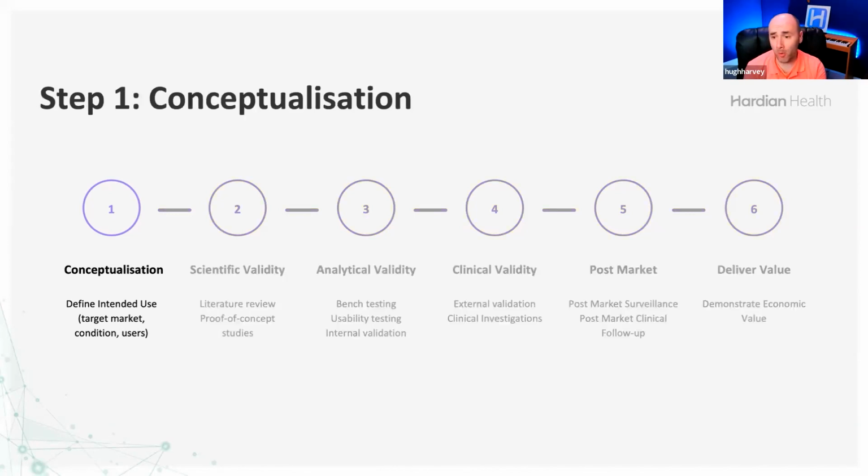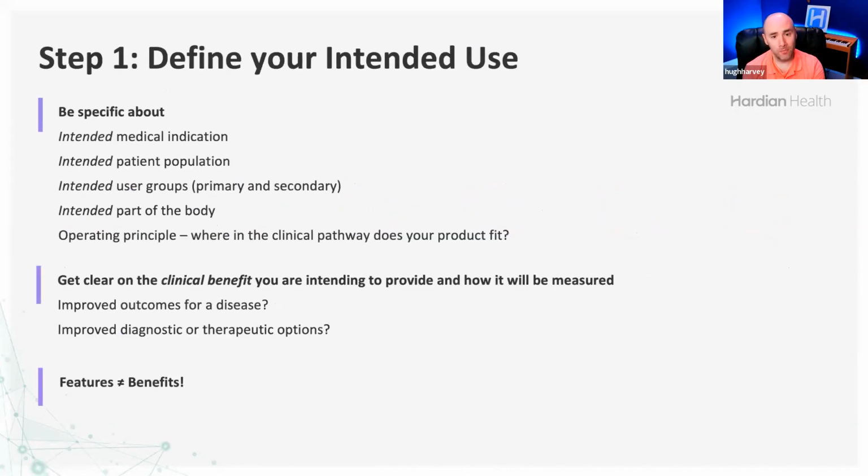So let's start with point one, which is the conceptualization framework in the timeline. This is overlapping with our regulatory webinar, as I've said, but just to clarify the key points. The regulatory term for what your device does is the intended use. A similar phrase is the intended purpose. They're sort of interchangeable. Intended use and intended purpose mean the same thing.